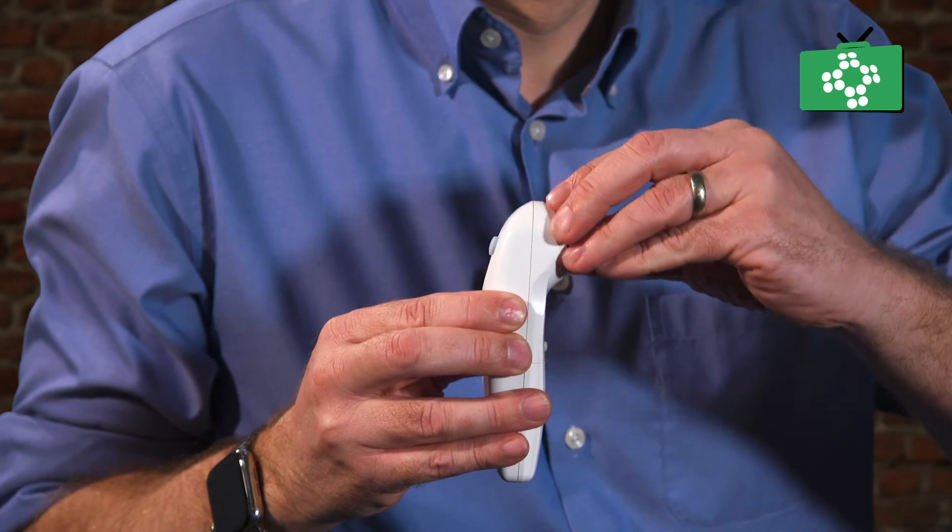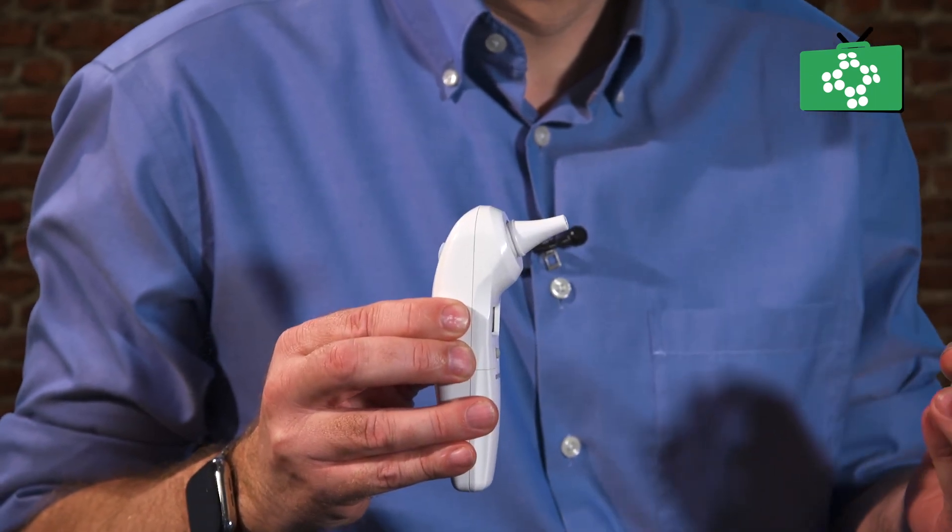Finally, with the ear thermometers, you need to remove the cover and discard it with clinical waste, remembering that every time you are using this, you would in fact be wearing gloves.